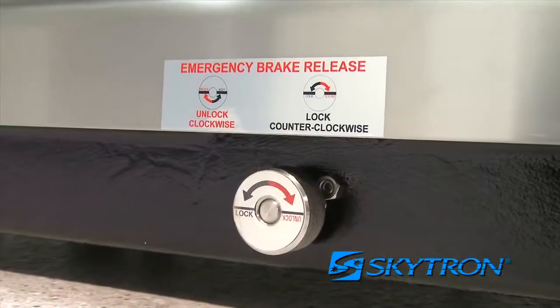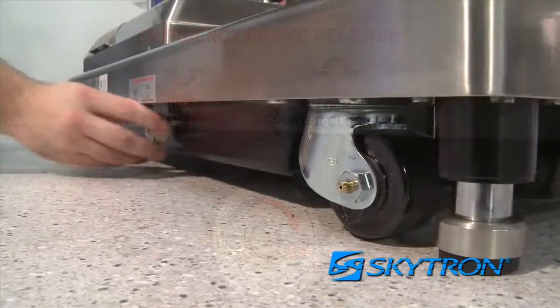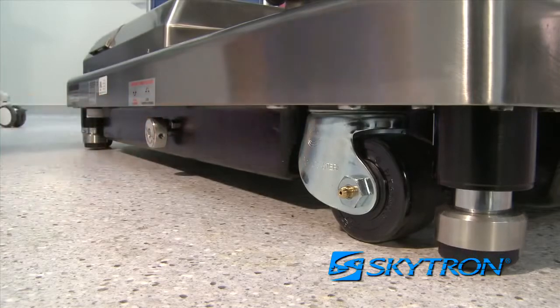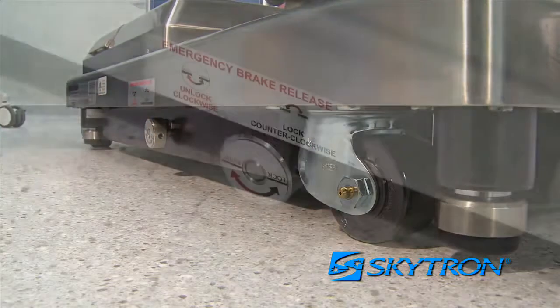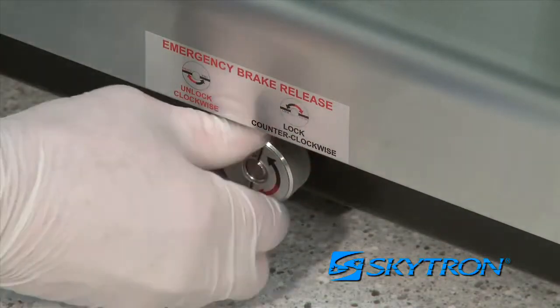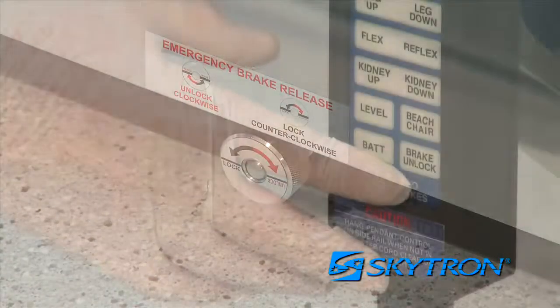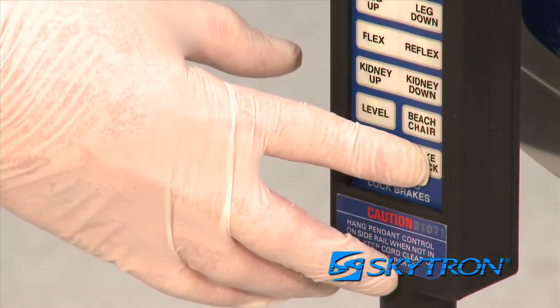The emergency brake release control knob is located on the side of the table base. Turning the knob clockwise will release the brakes, making it possible to reposition the table in an emergency. If the emergency brake release is used for any reason, the brakes must be reactivated by first rotating the control knob counter-clockwise, then pressing the brake lock button to recycle the brake system.